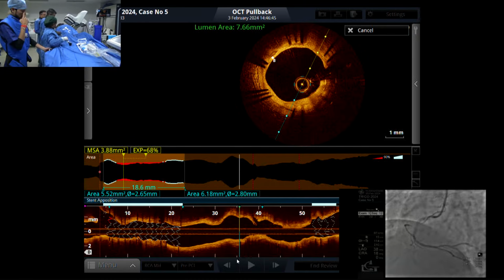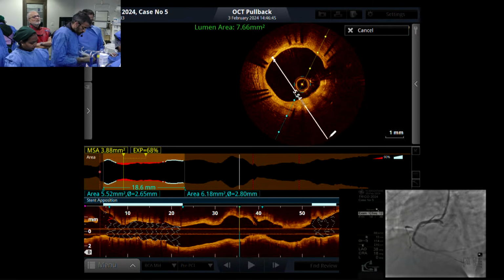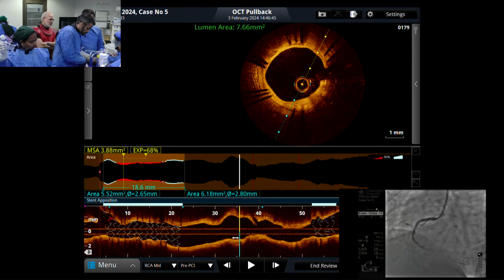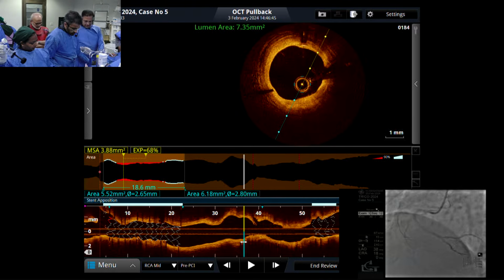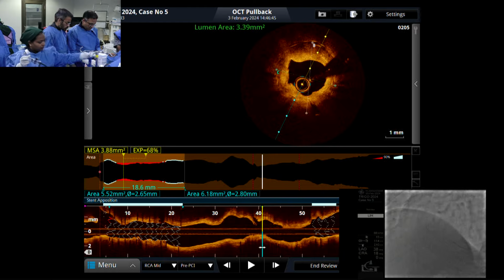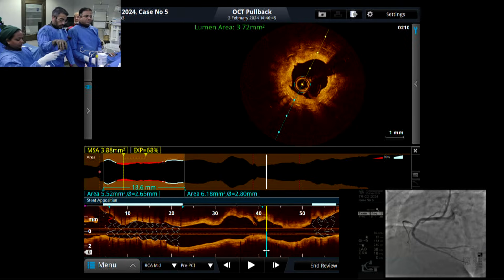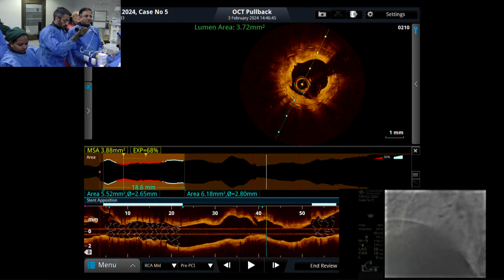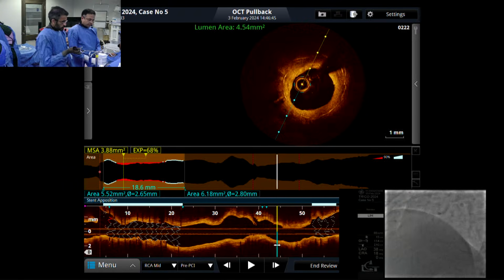The distal lesion looks perfect, absolutely. Ready? Will we do the cutting for all the stented segment, or the mid part only where we feel there is maximum ISR?